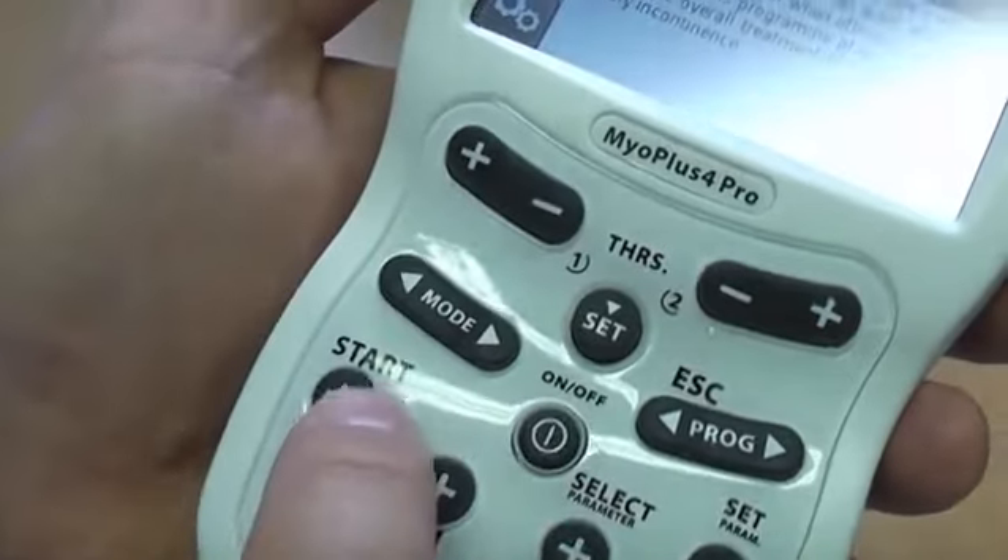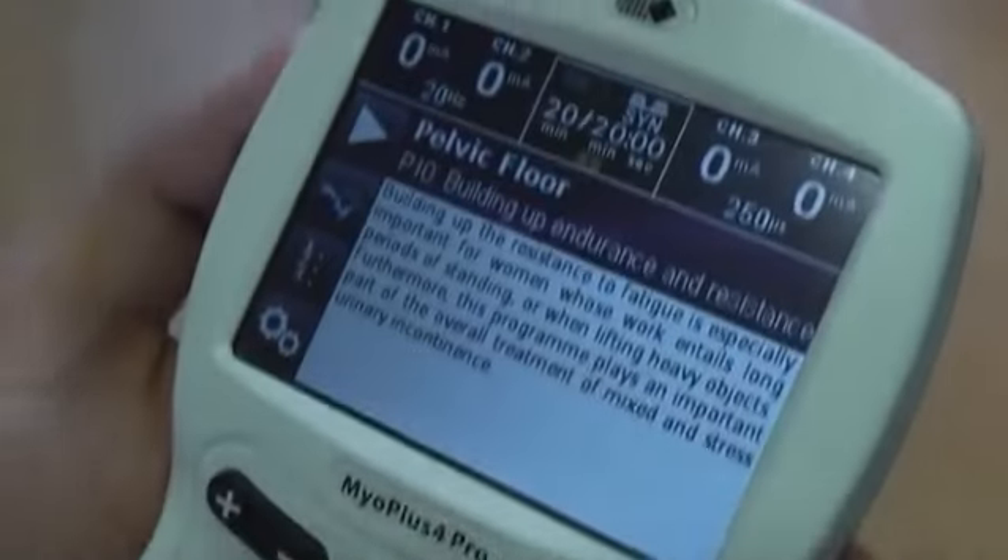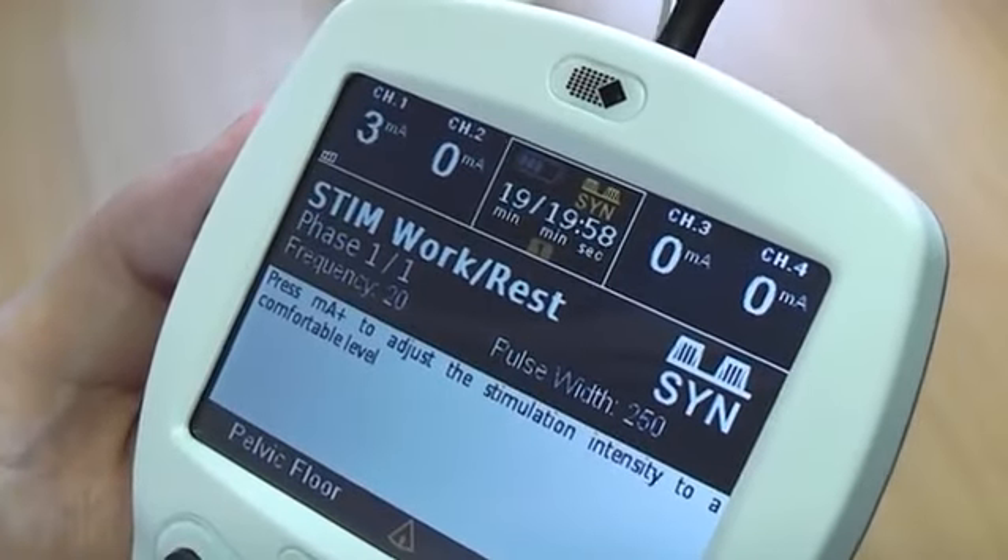After you have selected your preferred program, you can then start the program by pressing the MA plus button until you get a comfortable contraction.